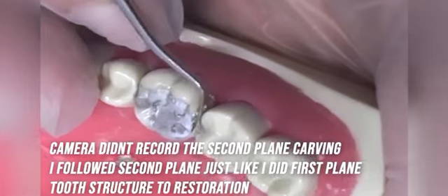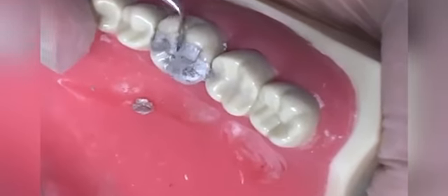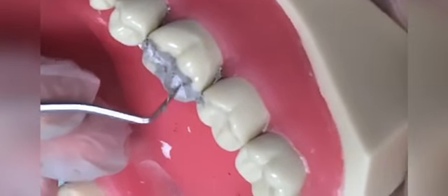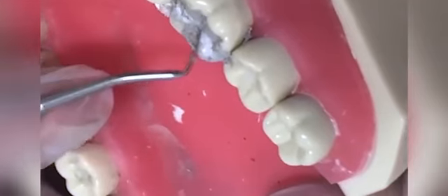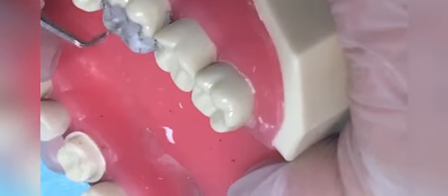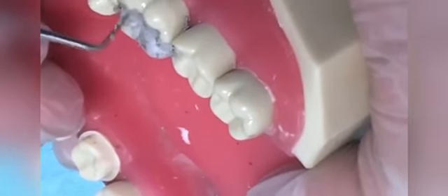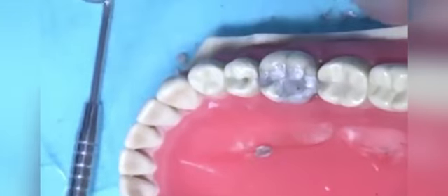Just remember that while you are doing the carving, the amalgam should not be set, it should be in a carvable state. Here we are creating the cusp, so we are working at an angle of 45 degrees, and on both sides we are sweeping away the extra amalgam. So it will create a high portion in the central and a depression on the sides. So we are almost getting there.